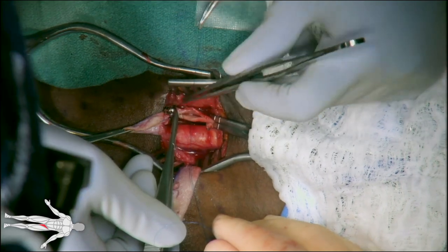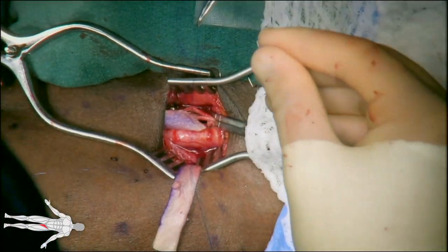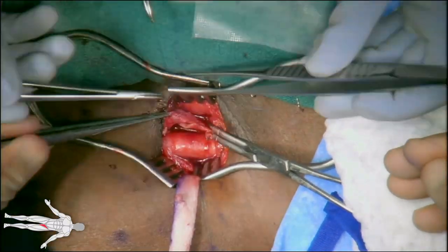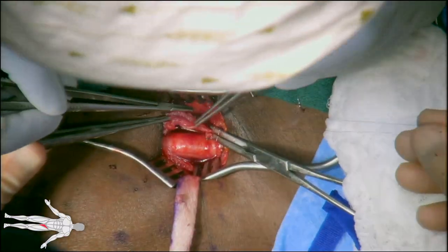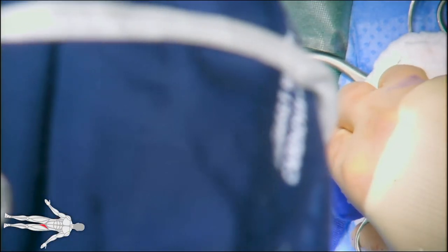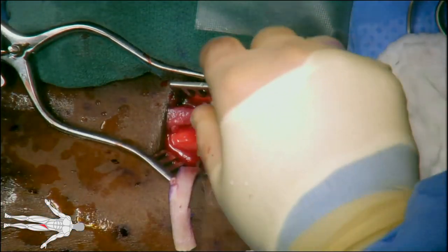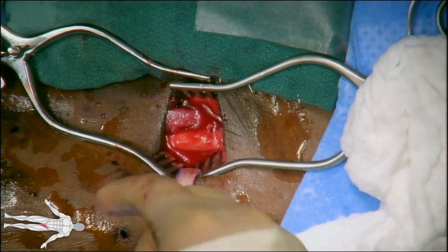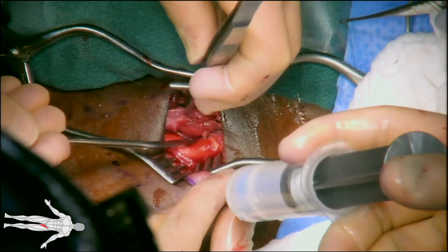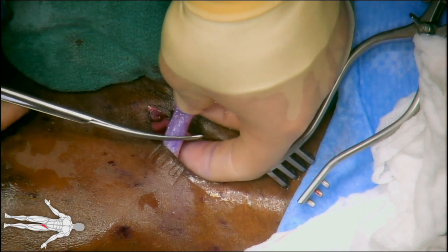This allows for adequate exposure while creating our end-to-side anastomosis between the graft and the common femoral vein. The end-to-side anastomosis is then constructed using a 6-0 prolene suture. The clamp on the common femoral vein is then released, followed by distension of the AV graft. The graft is then flushed with heparinized saline.